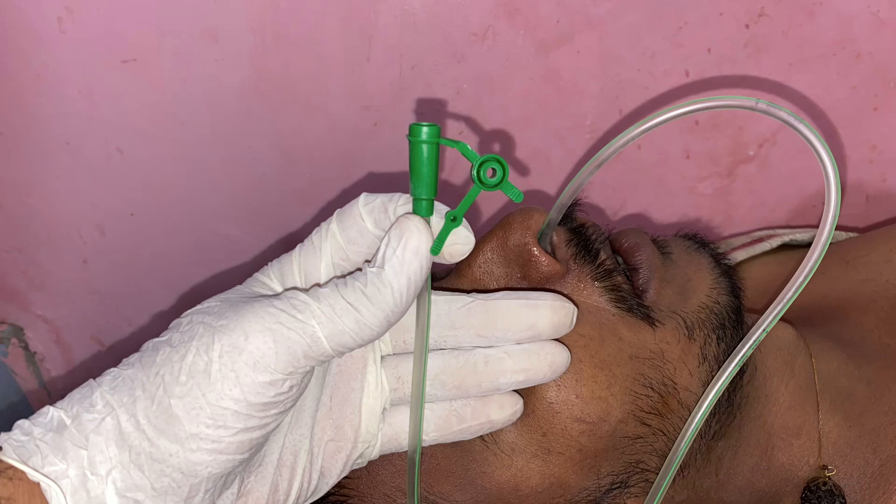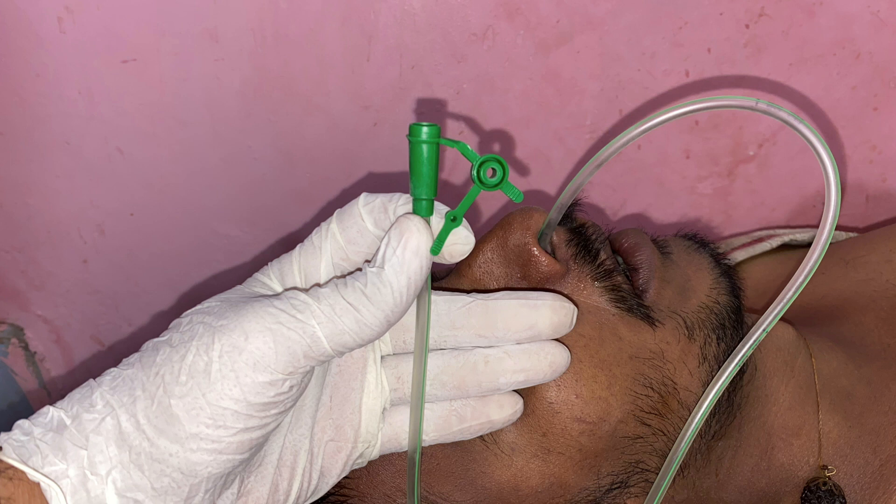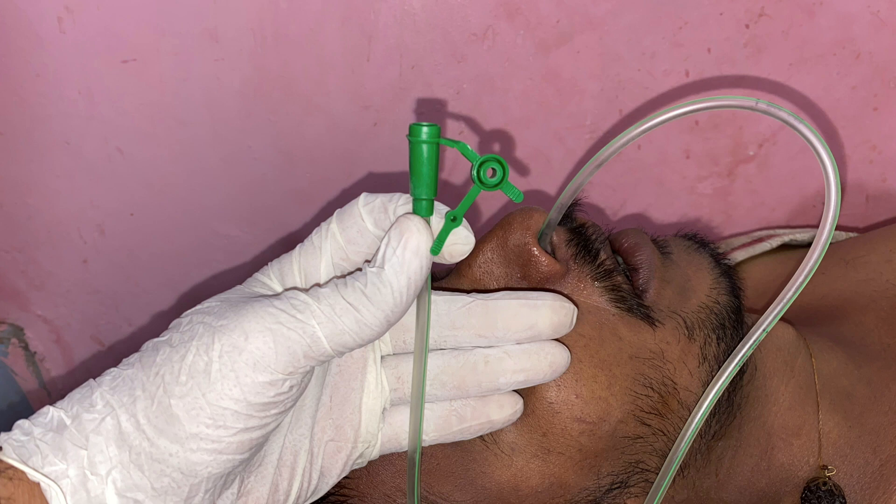Today we will discuss nasogastric tube intubation. By inserting this nasogastric tube, we are accessing the stomach and its contents. This can be used to administer drugs or decompress the stomach, and to maintain continuous drainage from the stomach to the external environment.